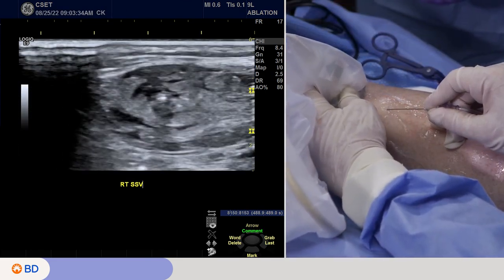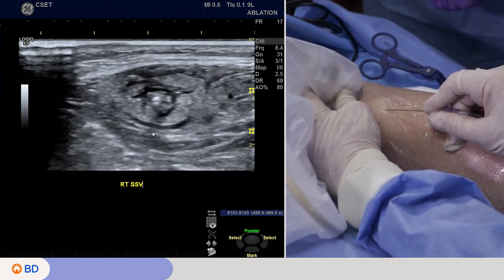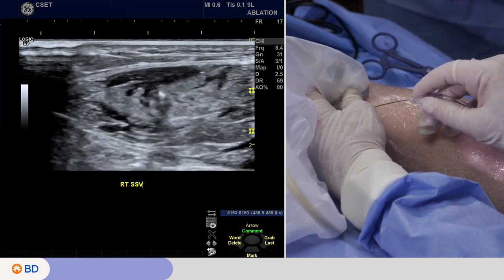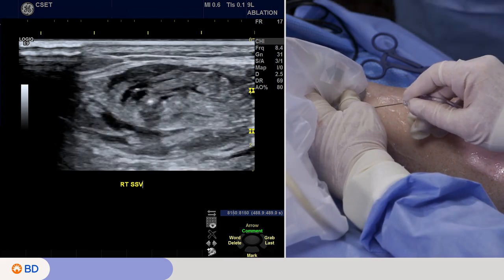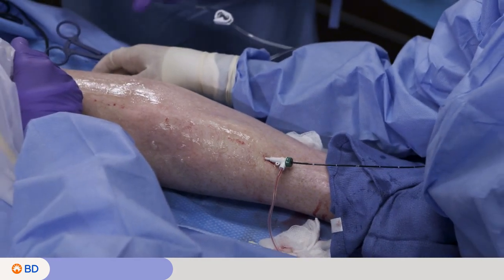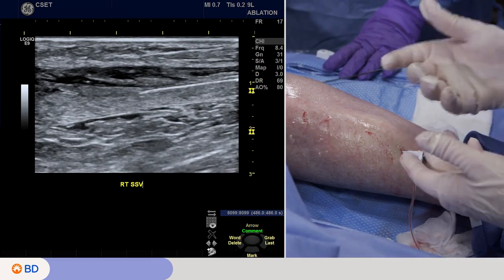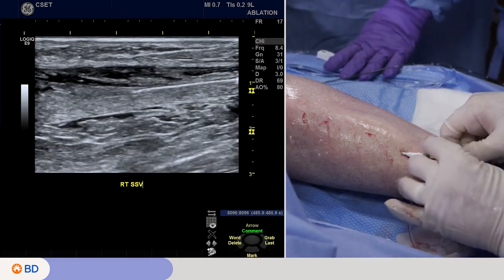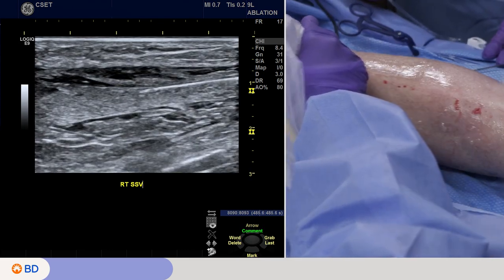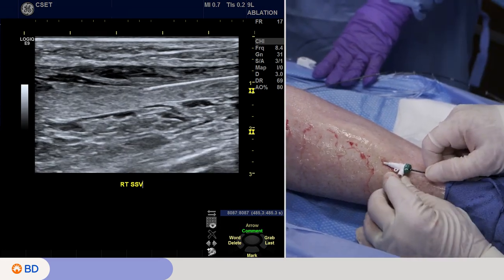We are at the tip, and you can see that nice shadowing — you know the tip because you see these three acoustic shadows, which is telltale for the coil. Other patients may have a lot of fibrosis and it's easy to be fooled, so it's vital to know exactly where your catheter tip is when administering heat. We want to move quickly once we have the tumescence in so it doesn't dissipate, and it's important to triple-check position at the top before initiating, because once you hit the button you're heating. I jiggle it and confirm with my sonographer — if we disagree, we have to convince each other where the tip is. We see the marker; we're very confident and in perfect position.